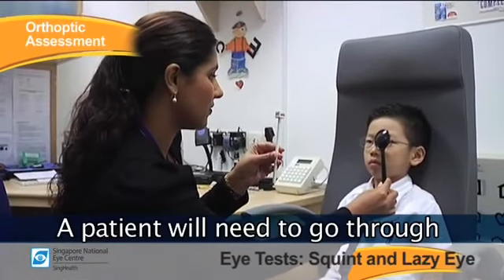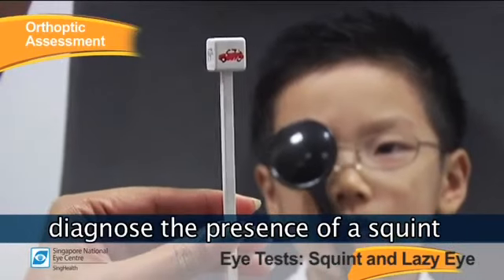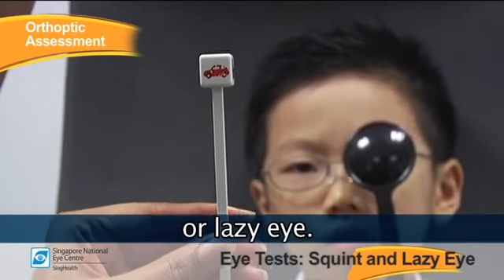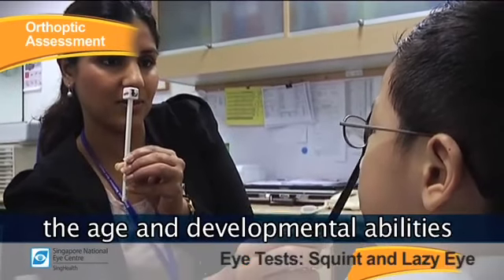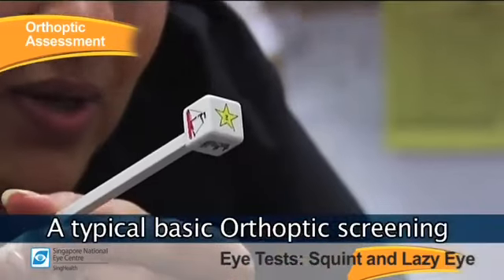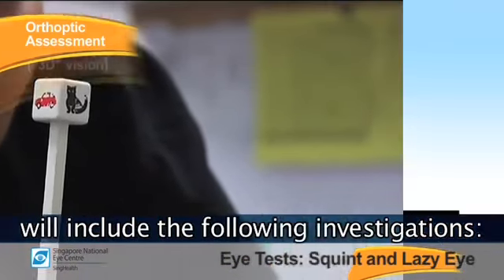A patient will need to go through a full visual assessment in order to diagnose the presence of a squint or lazy eye. The type of tests vary according to the age and developmental abilities of the patient. A typical basic orthoptic screening will include the following investigations.